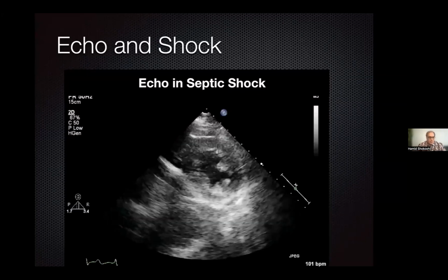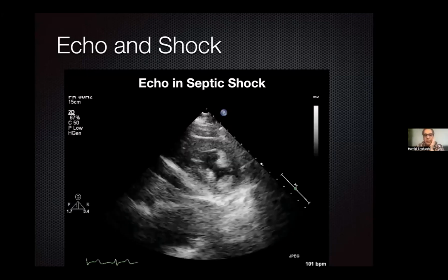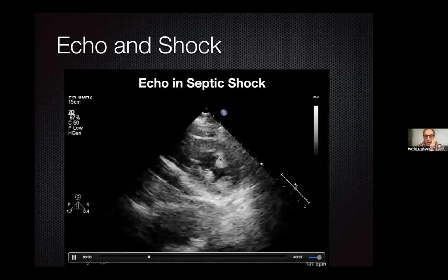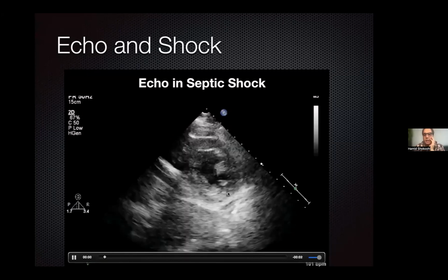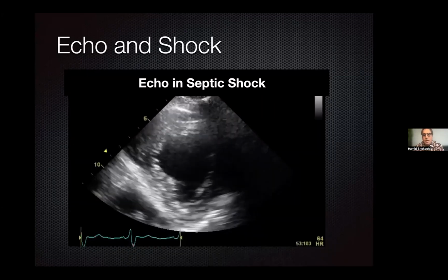Okay, let's focus a little bit more on the septic part. In the septic part, we said that, as you can see here, there is hypercontractility, and there is not a lot of filling, but most of the time the area near the outflow tract is preserved. Okay.